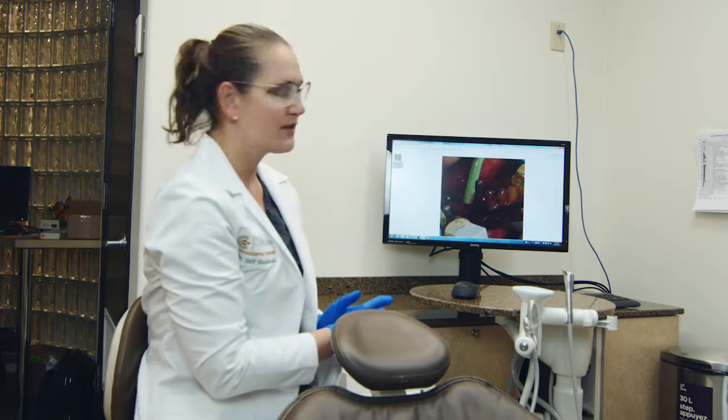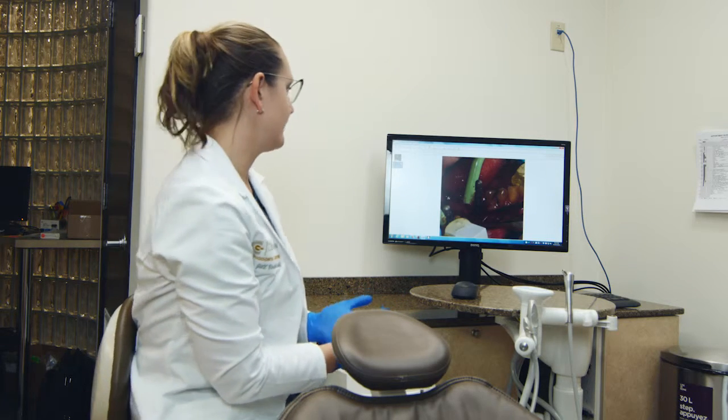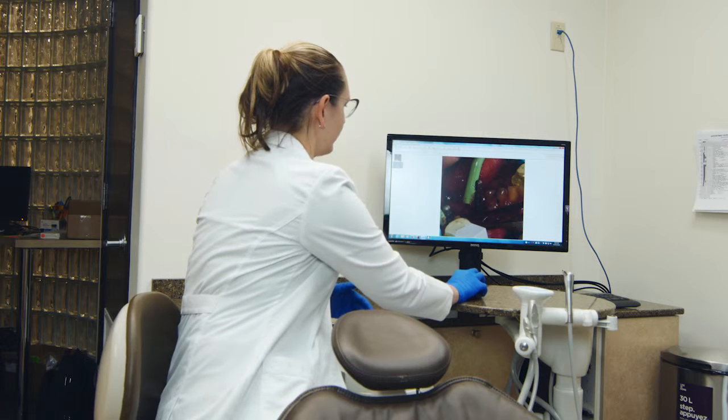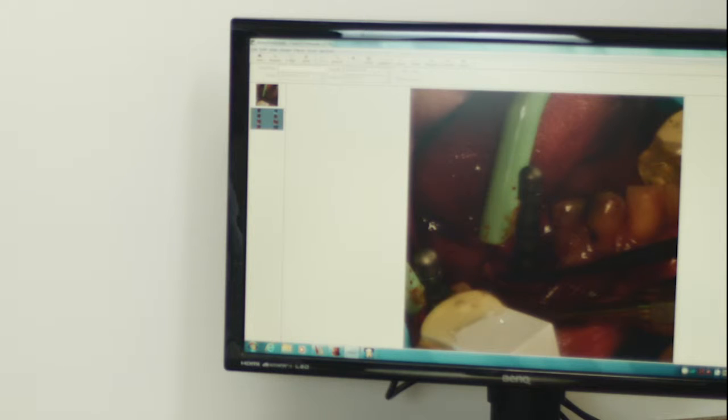And so I used the Inliant clinical navigational system, and here is just a clinical photograph I took intraoperatively, and you can see this fiducial is within the view, but it's not impeding my ability to actually work intraoperatively in the patient's mouth. And so it's very unobtrusive, and it allowed me, though, to very accurately and safely drill an osteotomy and size it appropriately so that it was safe for the patient in this challenging situation.